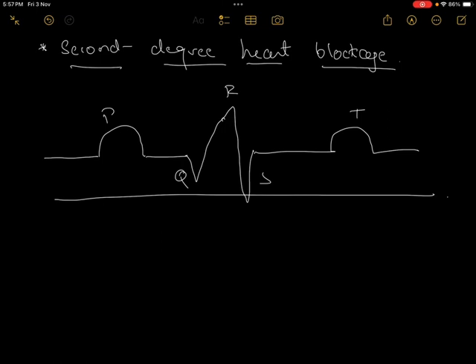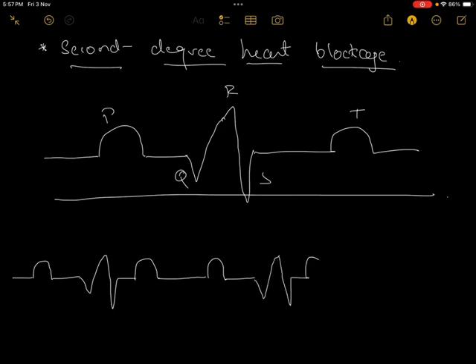Let me explain here. If we take a continuous ECG report, this is the normal continuous period of recording of ECG.